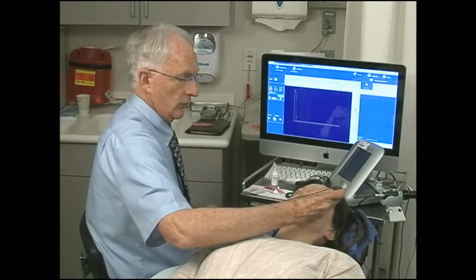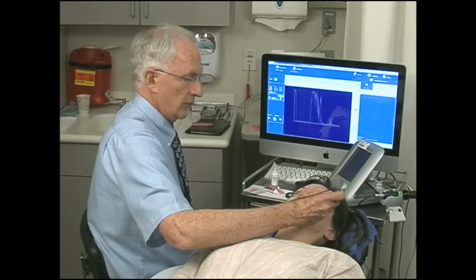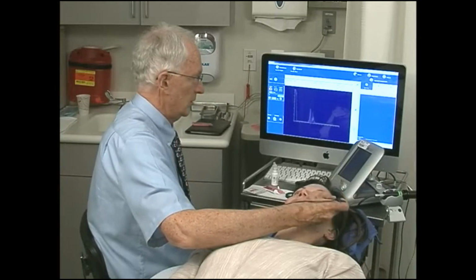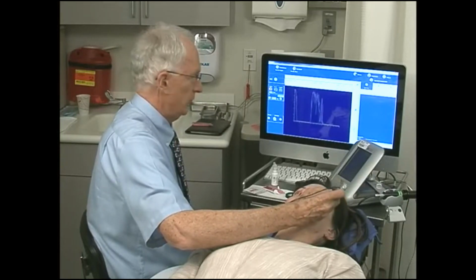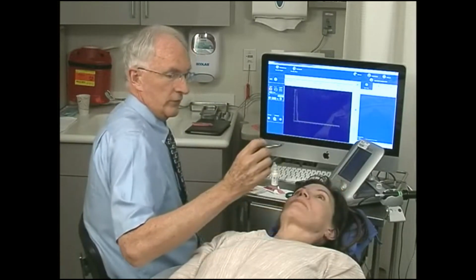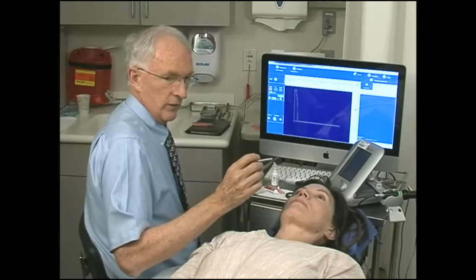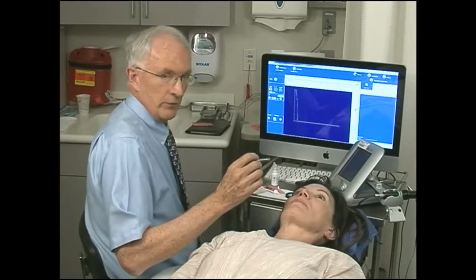You then place the probe again at the 4 o'clock position. And I'm scanning the superior nasal orbit. Again, going back and forth, trying to maintain perpendicularity of that initial retinal spike. I then can concentrate on specific orbital structures, especially the extraocular muscles and the optic nerve.